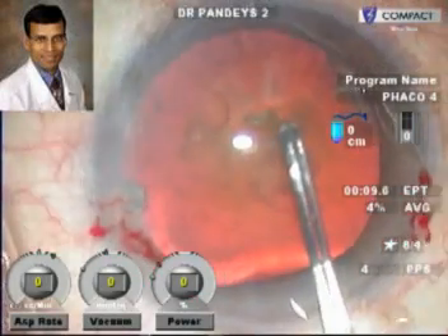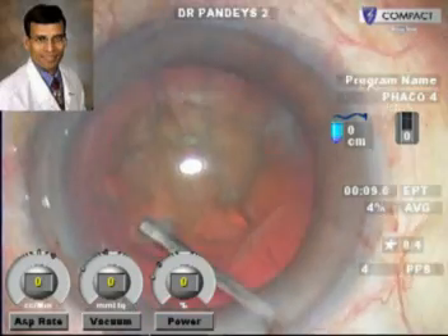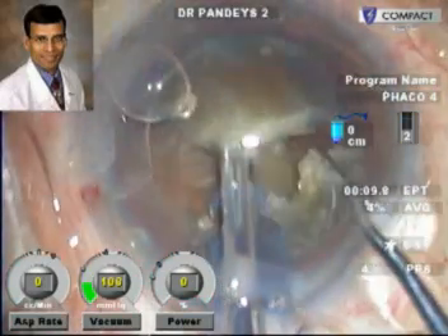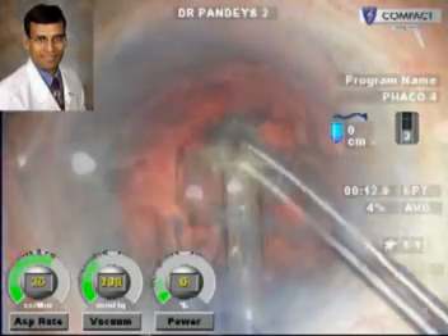This is the standard capsulorhexis being done followed by the hydro steps. This is the phacoemulsification. The nucleus here is moderately hard.